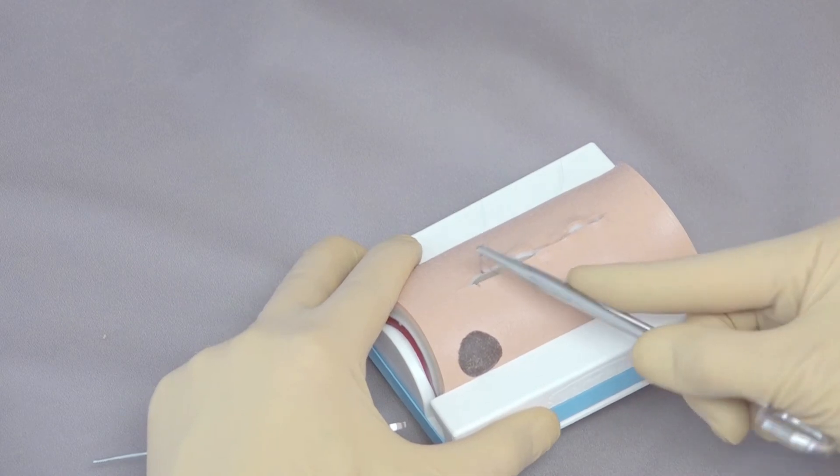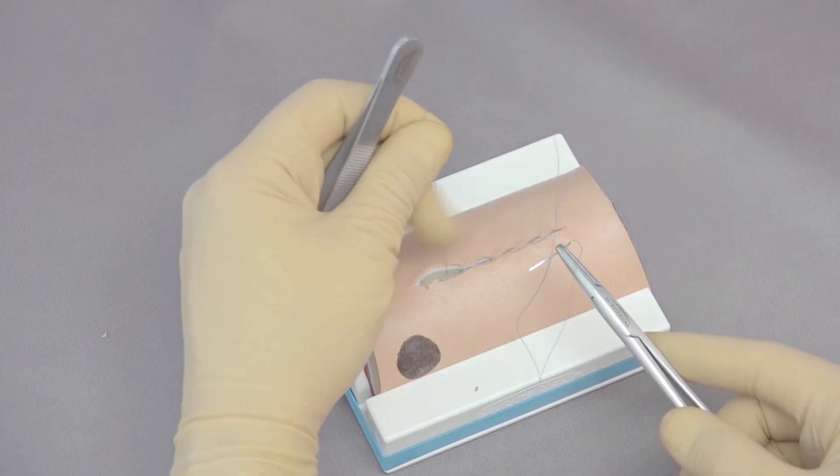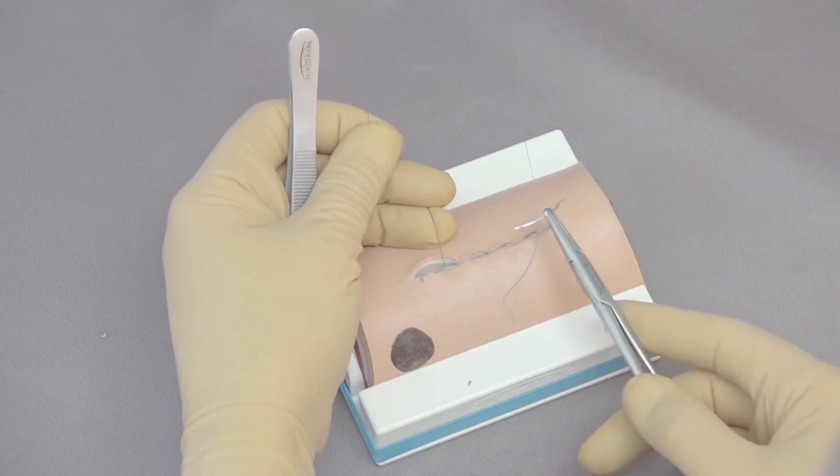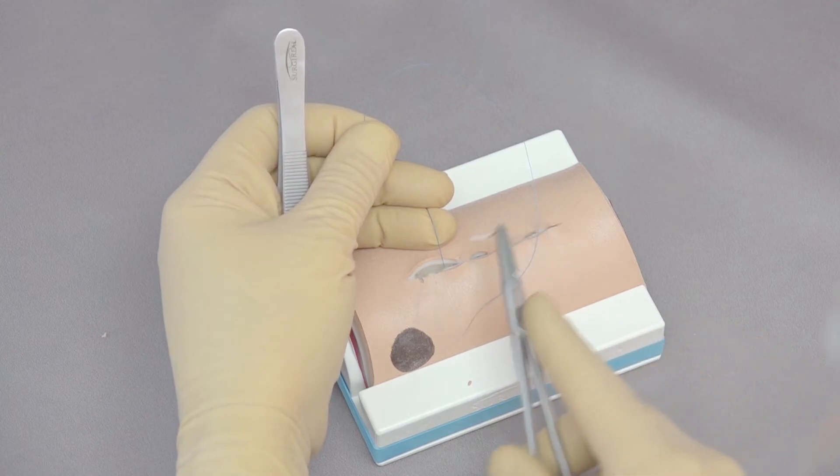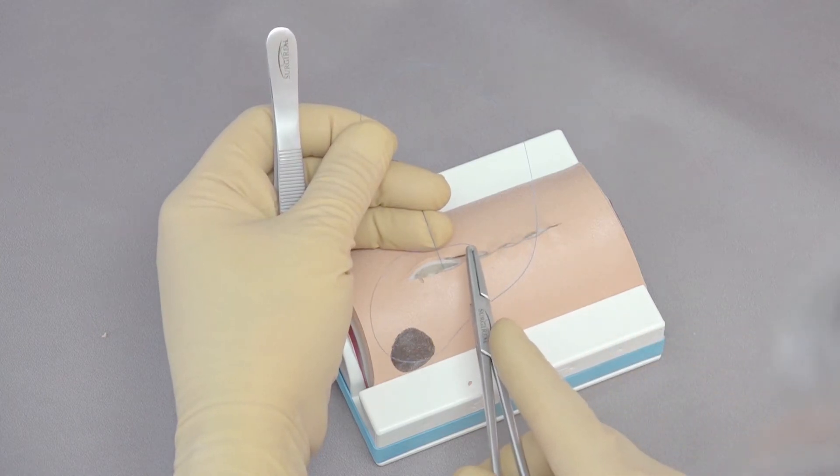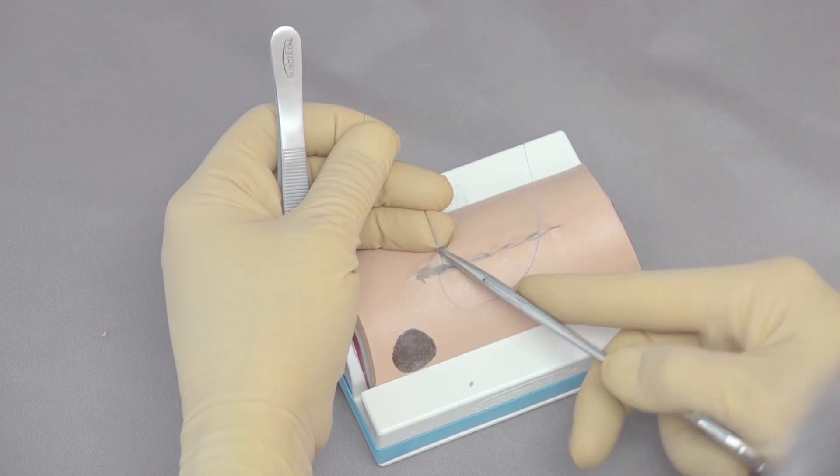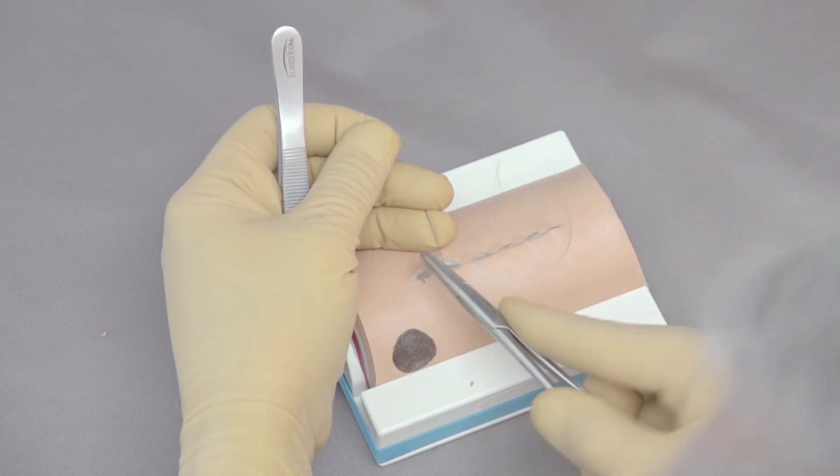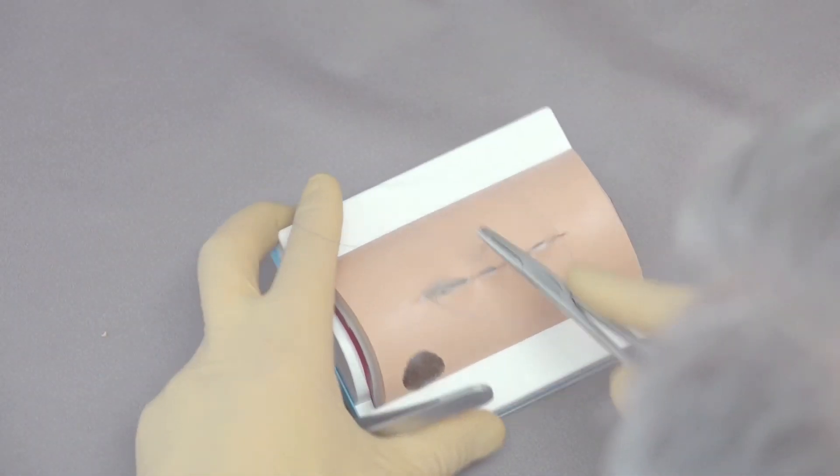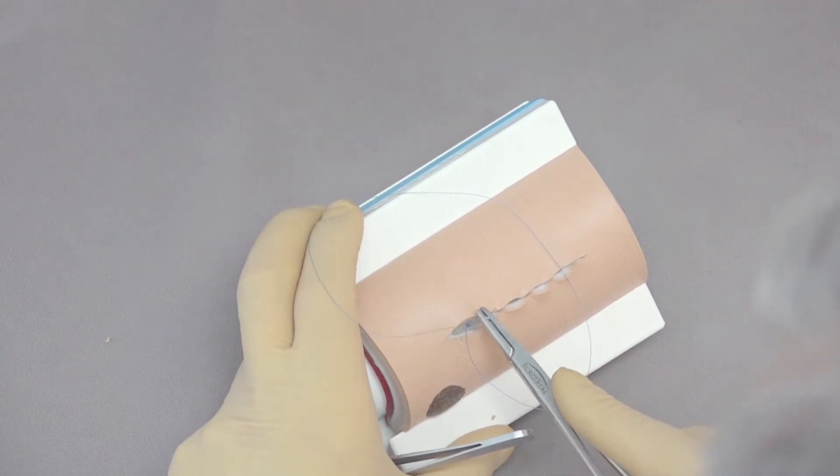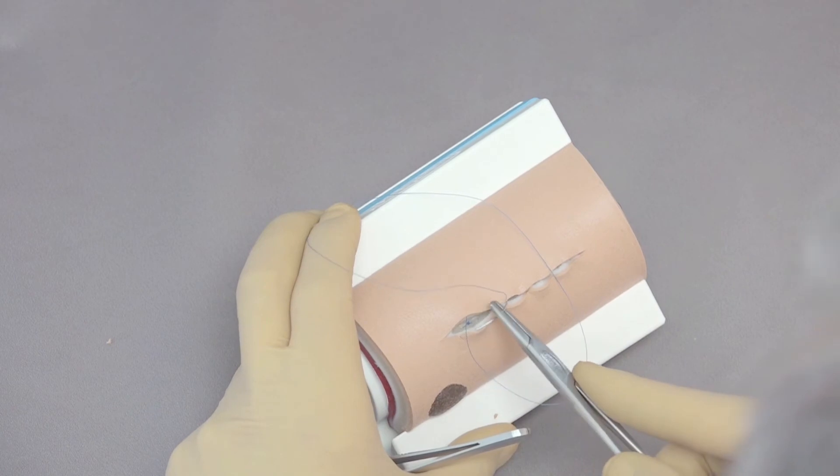Now as we get to the end of this, we have to start paying attention because it's time now to consider burying or not. So as I'm getting really close, if I get too far to the end before I start getting ready to tie my knot, I'm going to end up with not enough room to work in. So I think there's still enough room to do a little more. We can get one more suture here that's fairly close together. And then one more on this side that we can do something similar. So we've got that there, so we're going again right at the junction of the dermis and epidermis as we go through this.